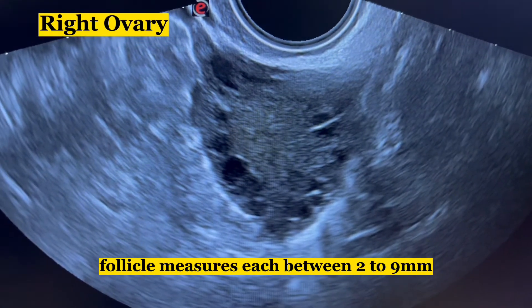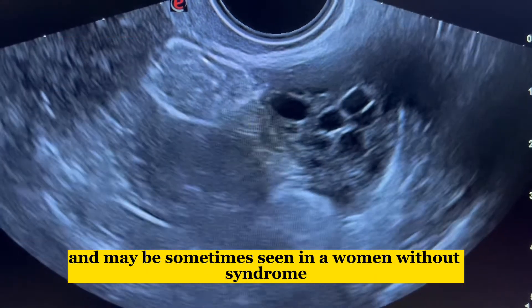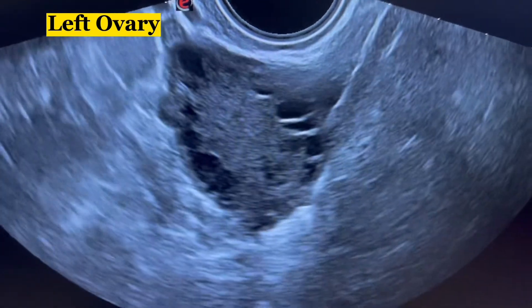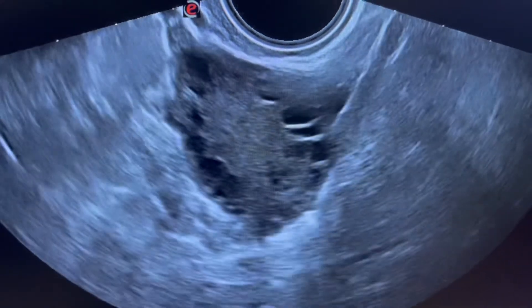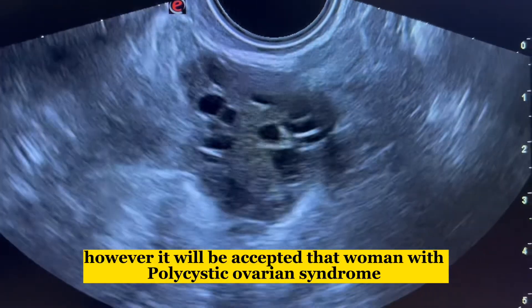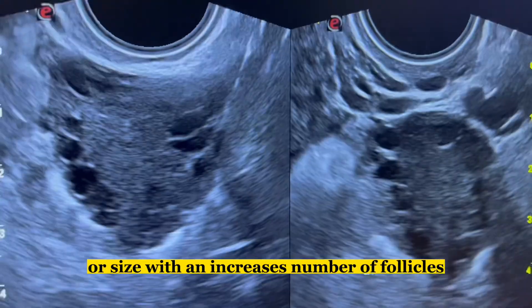Each follicle measures between 2 to 9 millimeters. Ovaries may appear normal in PCOS and may sometimes be seen in women without the syndrome. However, it is accepted that women with PCOS tend to have larger ovarian volume with an increased number of follicles.